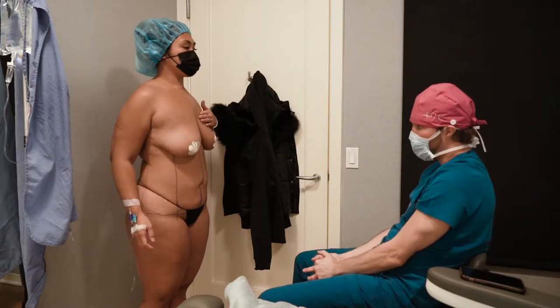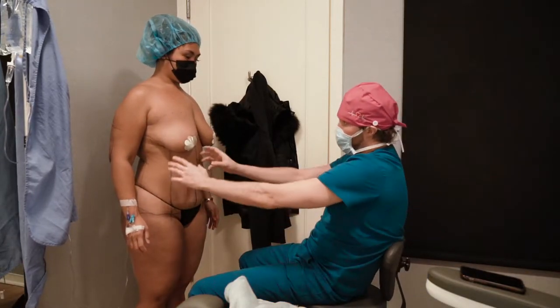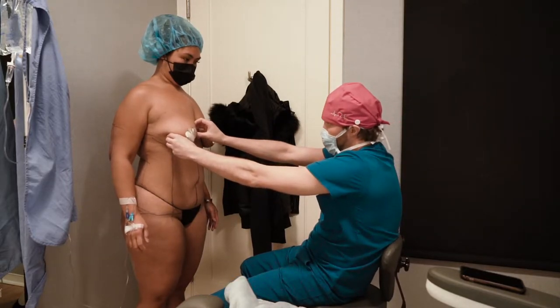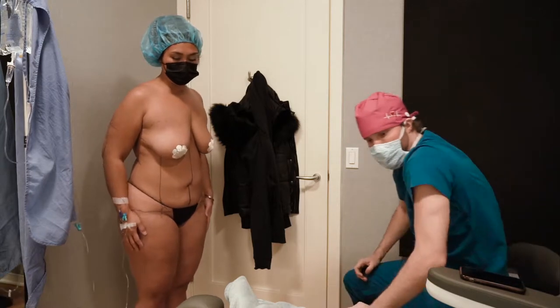It's also about how much your skin stretches, so let's see how it stretches. And then the breast — we put 500 cc implants, high profile — and we'll see how much lift we can get and add more volume. There's a chance you might need a lift in the future. Let's do it.